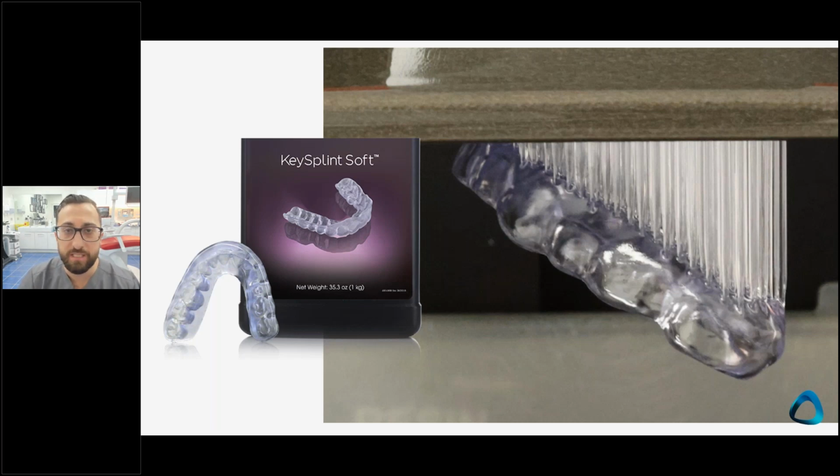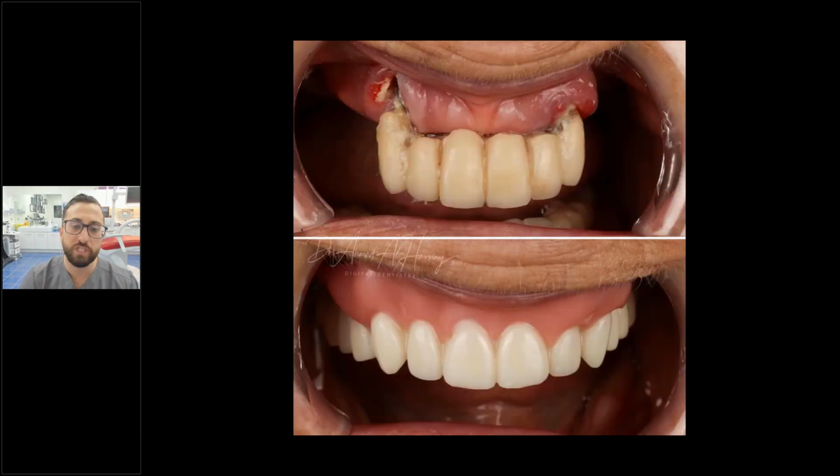And also dentures. Dentures is a massive thing in 3D printing, and I think it's just going to get better and better. I have a PM7, so I mill Ivotion dentures, but I also 3D print dentures, and I still think it's quite hard to beat a milled PMMA acrylic denture. It just looks so good. But 3D printing dentures is getting there, and you just can't beat this workflow.